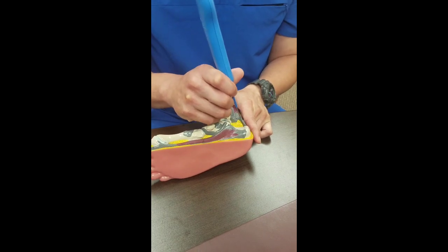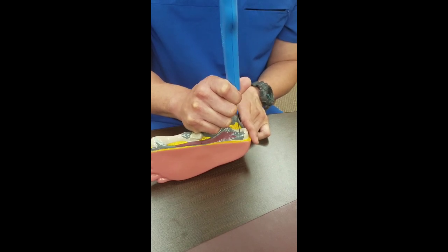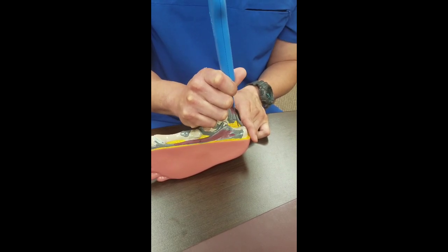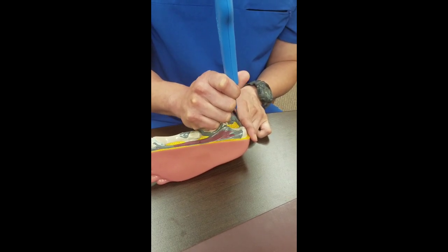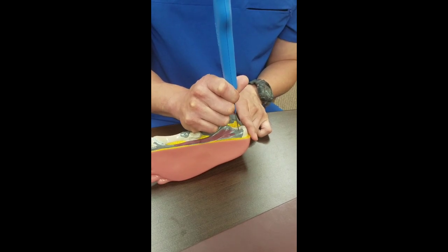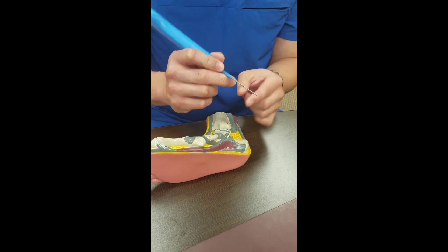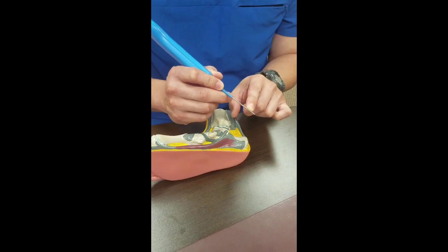So what do we do? Make a little stab. We go into this plantar fascia. With ultrasound guidance, we go in and out a few times with saline dripping as well as the vacuum going, and the vibration of the saline will break up some of that inflamed scar tissue, and then this tube right here will suck in all the debris, all the bad tissue that's been debrided.